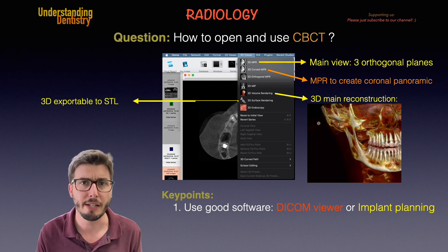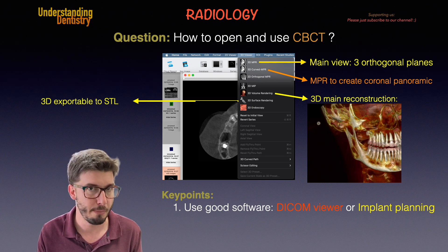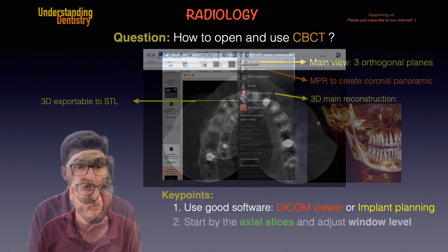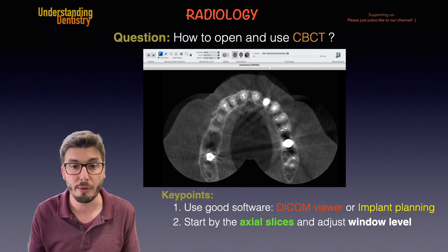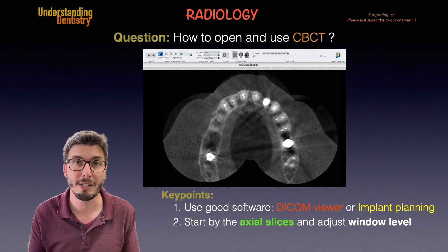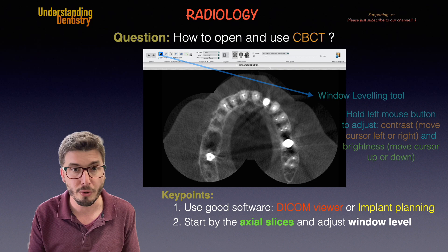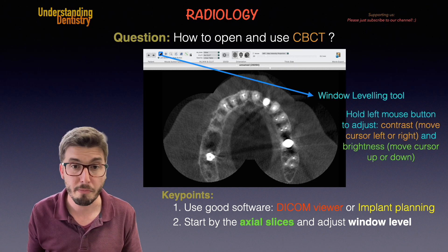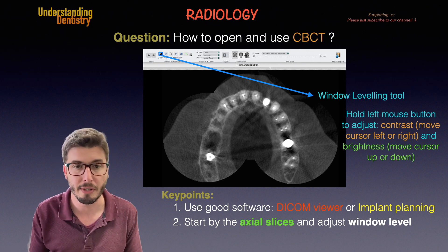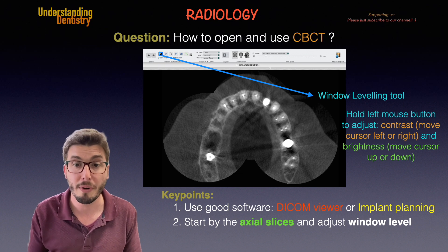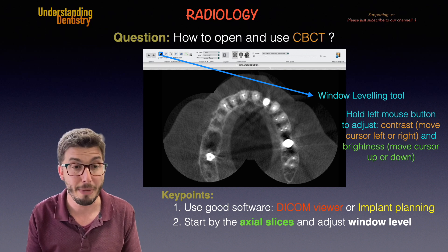We also have many other options: we can create regions of interest, calculate volumes, and do all sorts of volumetric analysis, as we should when doing a 3D assessment of the patient. The second key point is to always start by navigating through the axial slices, and then adjust the window level. Window level is the adjustment of brightness and contrast — the balance between brightness and contrast levels. We do this using the window leveling tool: hold the left mouse button and drag left or right to adjust contrast, or move up and down to adjust brightness. This method applies to all DICOM viewers.